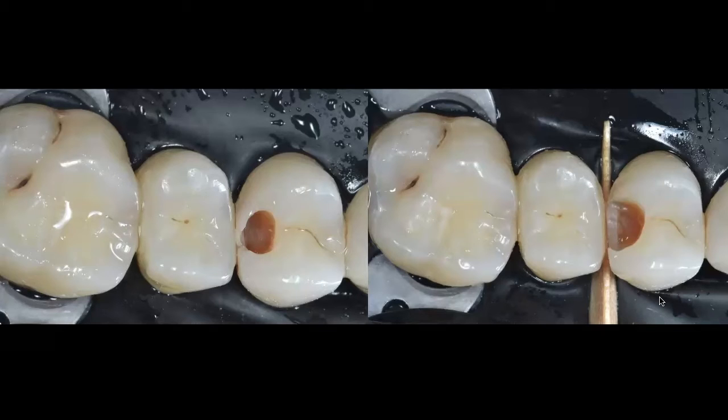I would probably use for this a 245 burr. That's probably what I use for this case. And all I want to do is use that cylindrical long burr just to slowly push buccal and lingual closer to the lingual and the buccal embrasures. Because again, I know that this cavity, this preparation, is going to end up being fairly wide buccolingually, as you can see on the right hand side.